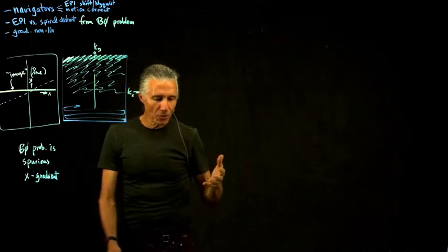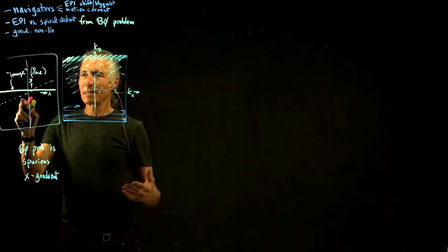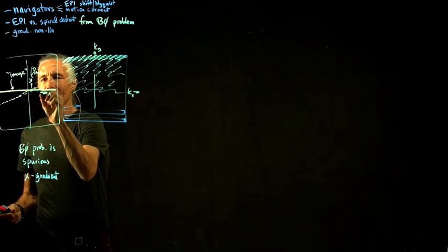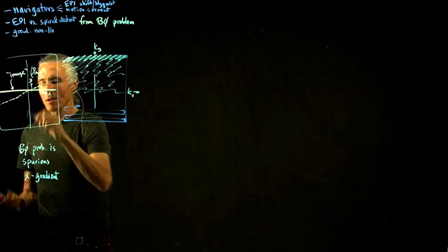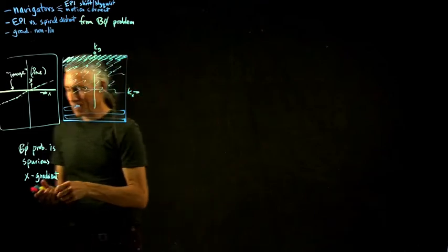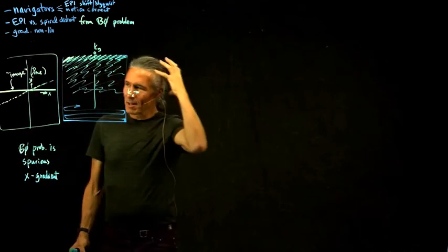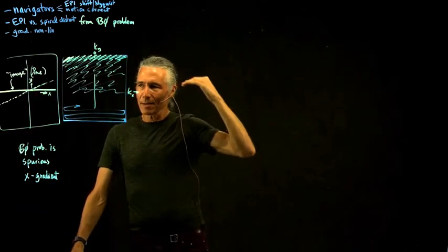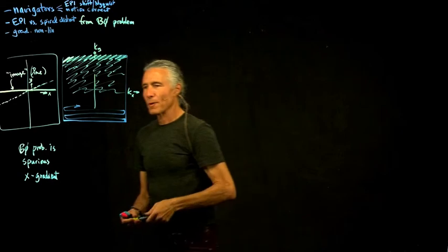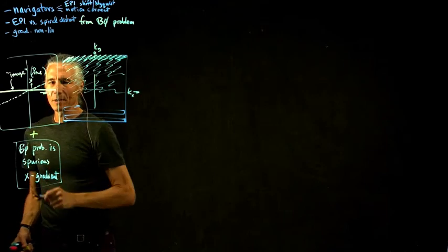And one of the things you can use for shimming is the gradient. So say our shim calculation went a little bit bad, and we put a gradient on that we shouldn't have, or we turned a gradient off that we shouldn't have. There should have been a little gradient to flatten the field, because for whatever reason the person has a head that's bigger on the right side, and it needs a little bit of a gradient to keep the B0 completely flat. So this is our problem: a line plus a spurious gradient.